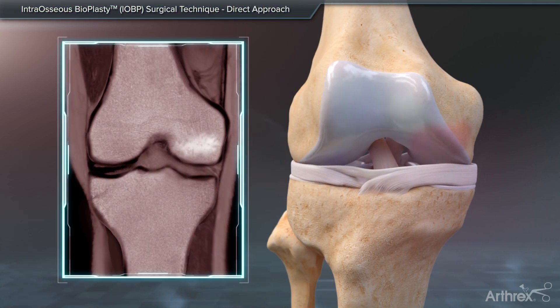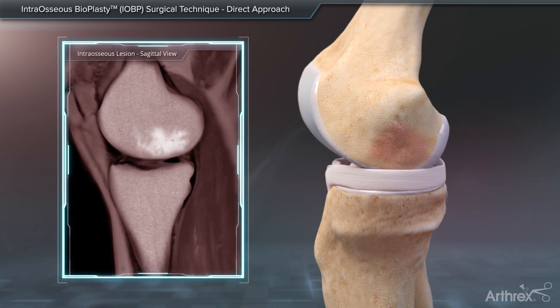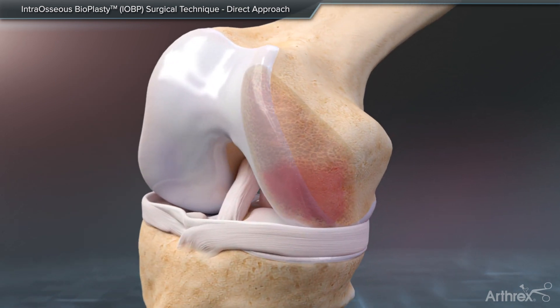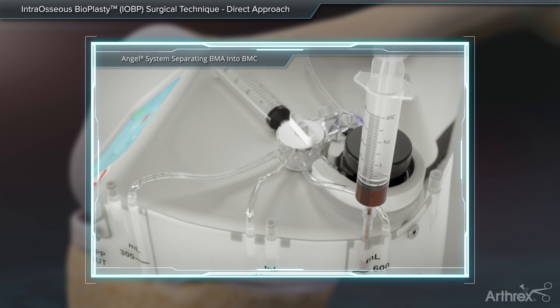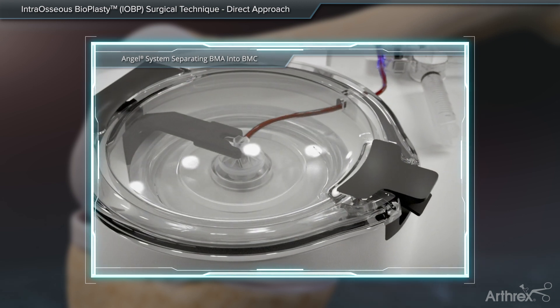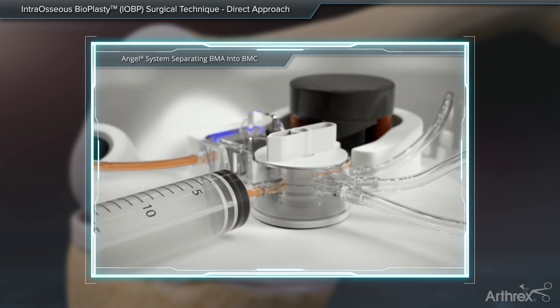Intraosseous bioplasty is the treatment of bone pathologies resulting from acute or chronic injury, including bone marrow lesions and spontaneous osteonecrosis of the knee. Arthrox offers options for the treatment of these pathologies by performing a core decompression of the lesion and a direct application of concentrated bone marrow aspirate using the Arthrox Angel System.